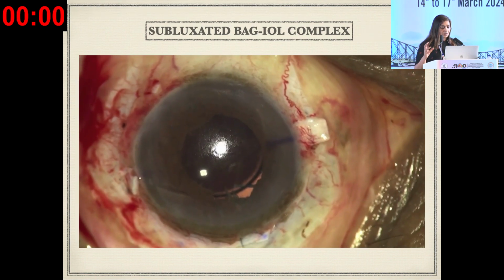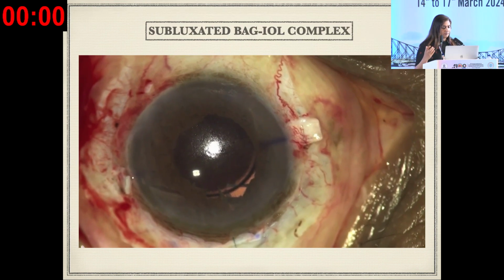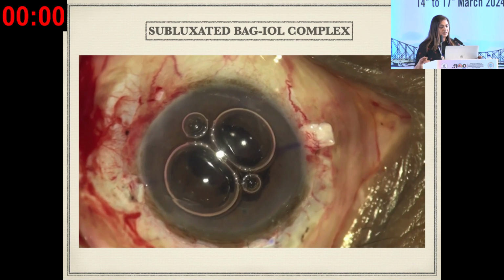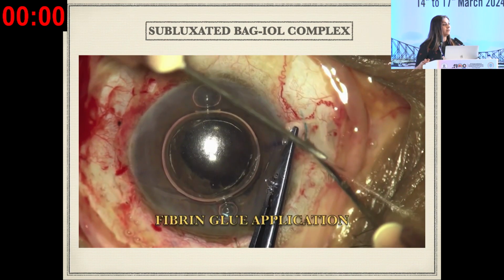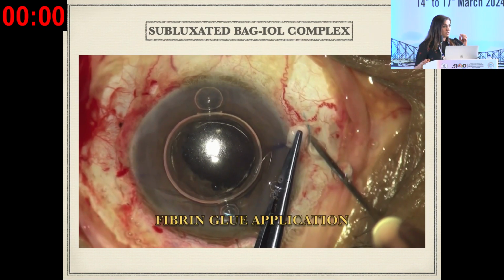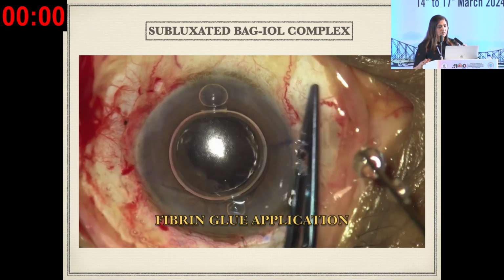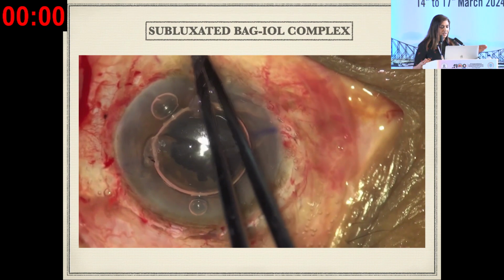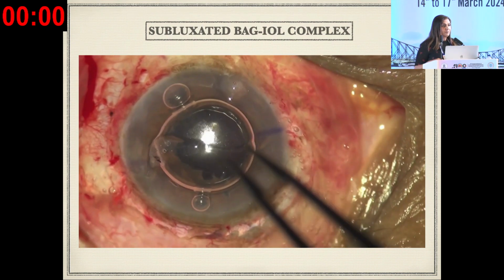The globe stability comes in and the eye looks quite taut at the end of the procedure. So you can just seal this off. I always have a habit of putting an air bubble into the anterior chamber, because it also helps me gauge if there is any vitreous out there or not, because otherwise it would just go a bit offset. And this is how you seal this up and things look quite good.